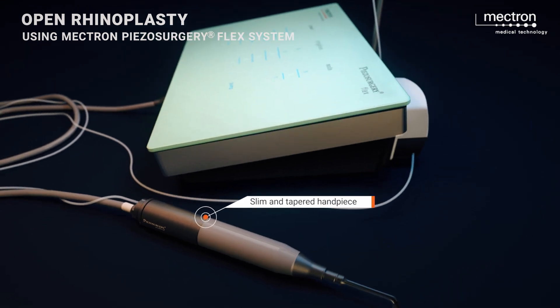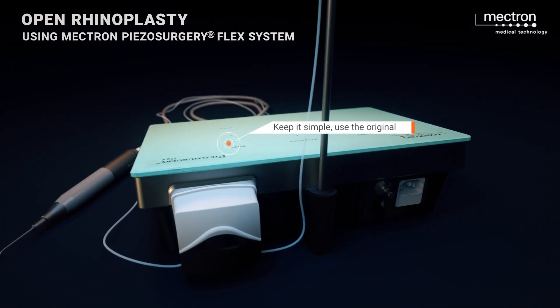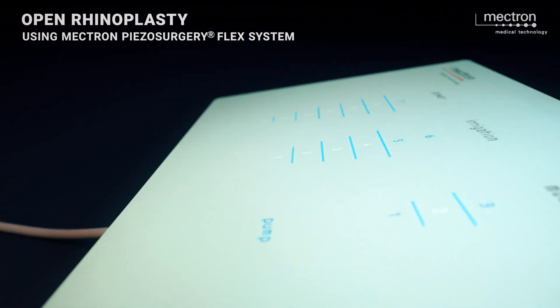Piezosurgery Flex is the essential device. With its perfect control, precision, and ease of use, it is your perfect start into a new era of bone surgery.